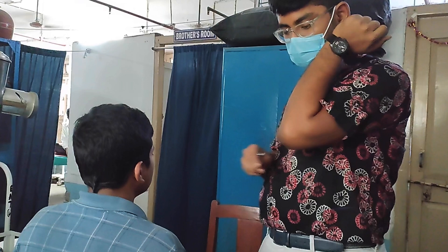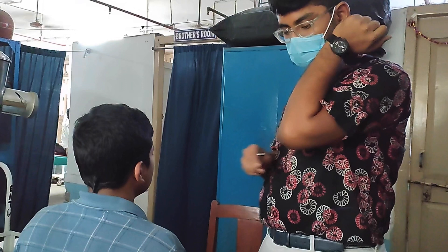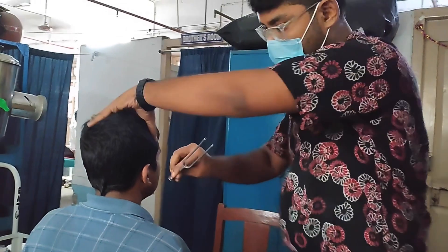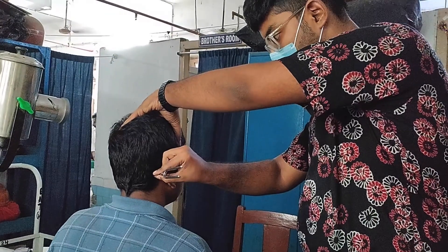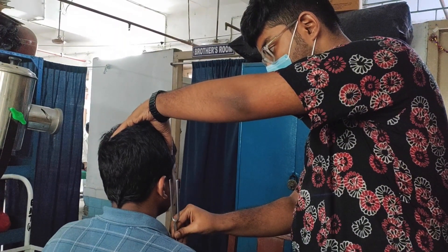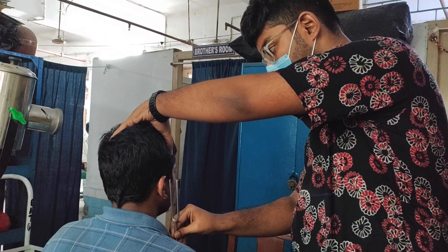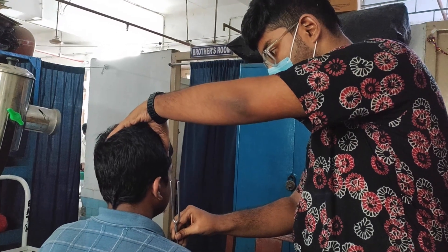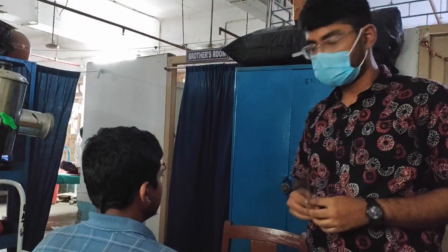Now showing the same Rinne's test from a different angle so you can exactly see where on the mastoid I am placing the tuning fork. I have placed the tuning fork on the mastoid, and there the patient lifts his hand. We then shift the tuning fork in front toward the opening of the external auditory canal. That was Rinne's test.